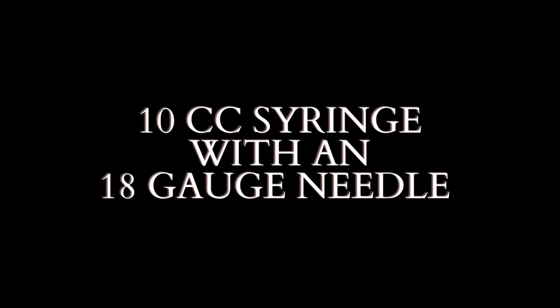Bandage scissors are the scissor of choice to cut a baby's umbilical cord. The umbilical cord doesn't have any nerve endings, so the baby doesn't feel pain when it's cut. The words 10 cc syringe with an 18 gauge needle appear in white on a black background.